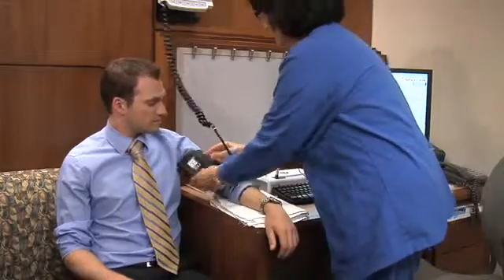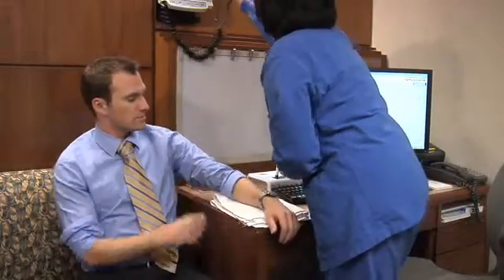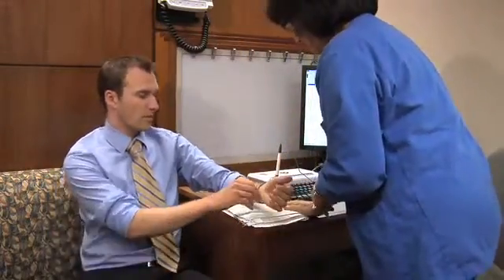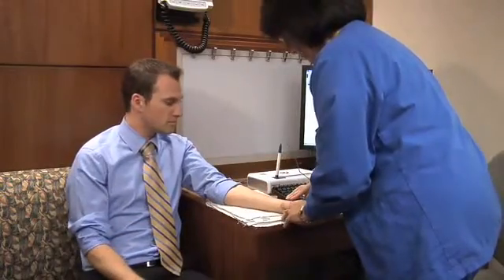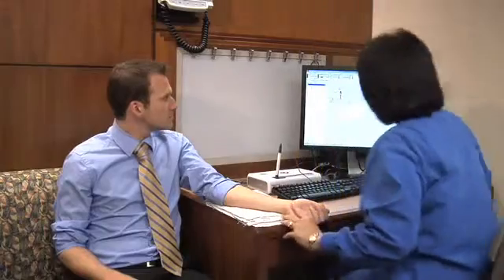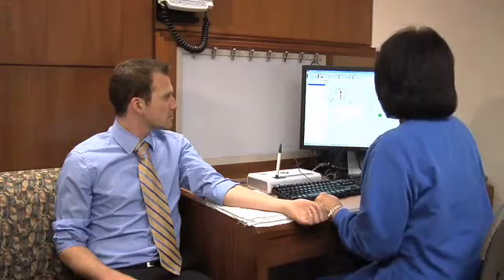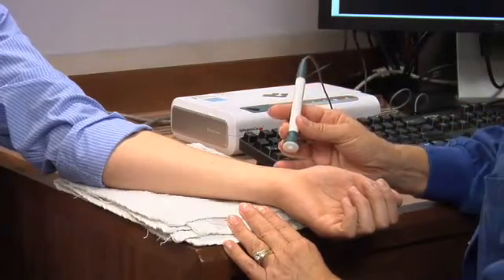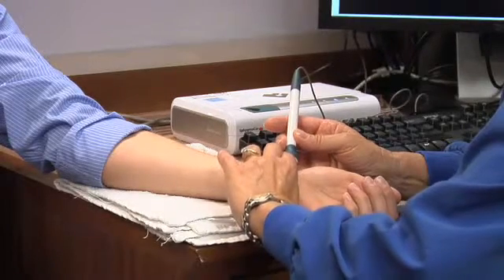The blood pressure machine is finished, and your blood pressure is 108 over 70. I'm going to remove the cuff now and I will ask you to take your watch off, roll your arm over, and I'll be placing this probe over your radial artery to get waveforms. I'll enter your blood pressure into the data. Now I'll be placing the probe over your artery, and we'll be getting a waveform across the screen that will actually be your radial arterial pulse.